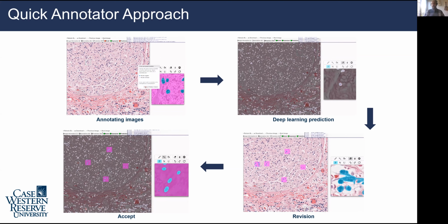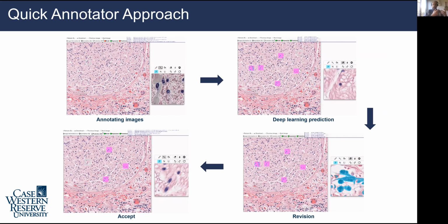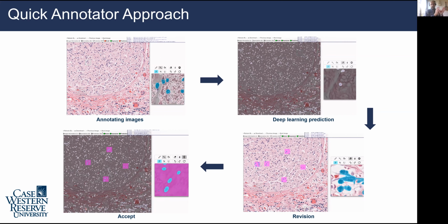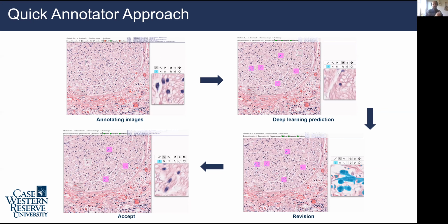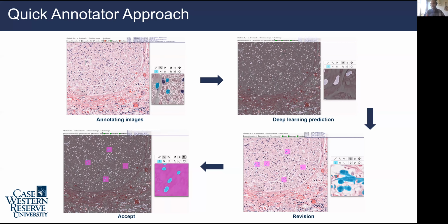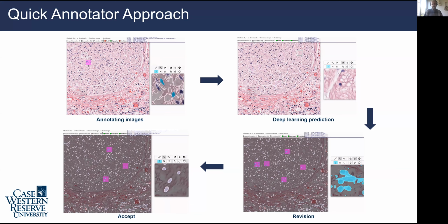So it's going to take a few minutes to train instead of, let's say, a week to train a 20 million parameter model. Now, I think the value there is you get feedback a lot faster, but we provide code that accepts all of the outputs from these tools. So the Quick Annotator outputs and the Patch Sorter outputs, and accepts those as inputs. And then you can go and say, now I'm interested in training a very robust model. I'm willing to wait 3 days for that training to take place, which is typical for a regular deep learning experiment. And you can click run on that and then end up with an even more robust model based off of the inputs that you provided.